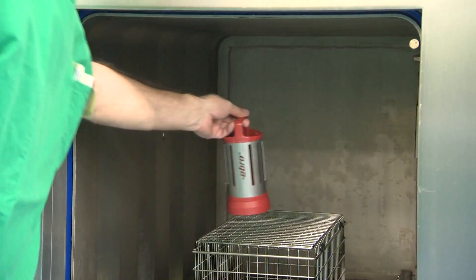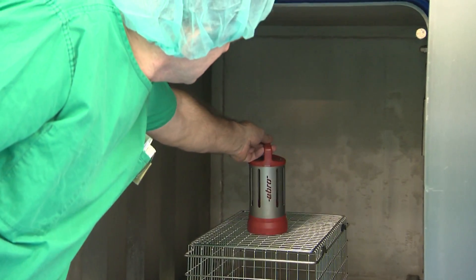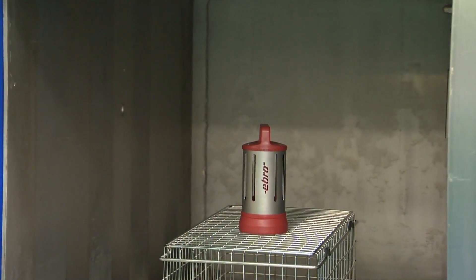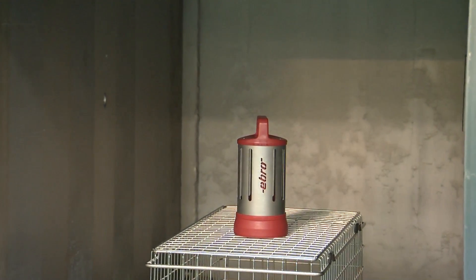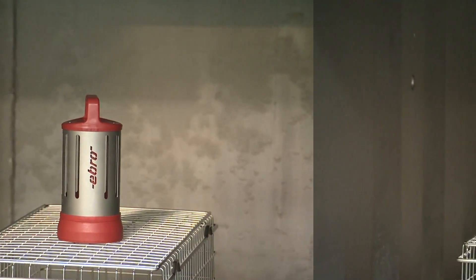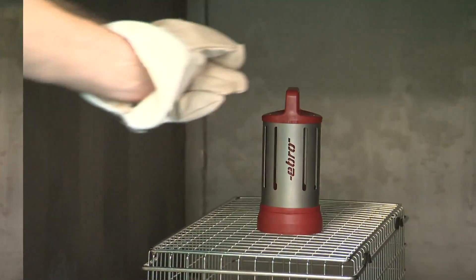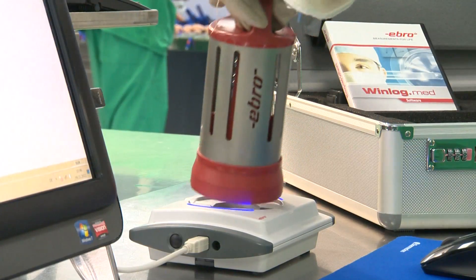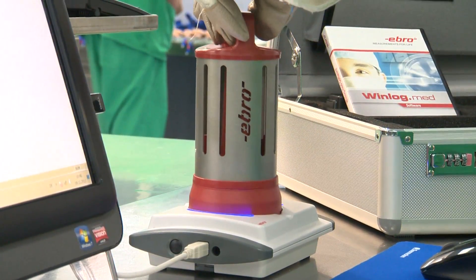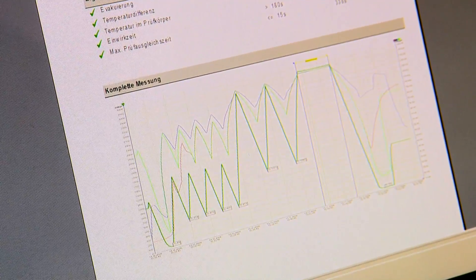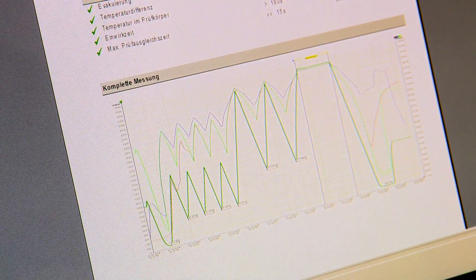The Bowie and Dick test software monitors the vacuum and sterilization phase of the sterilizer in its entirety, displayed in a graphic representation. The program identifies both a defect-free sterilization cycle as well as one exhibiting defects.